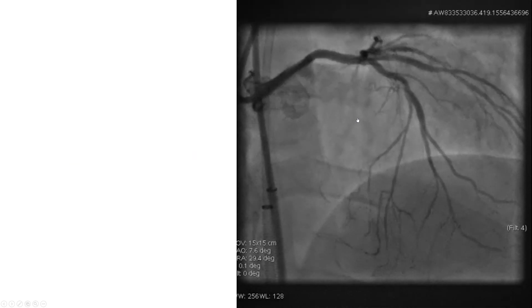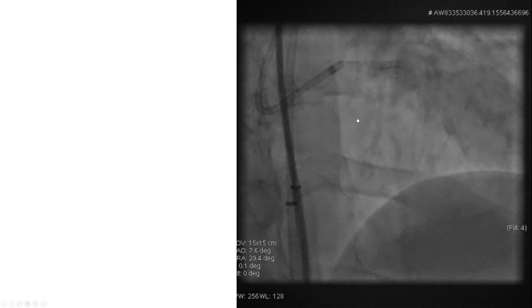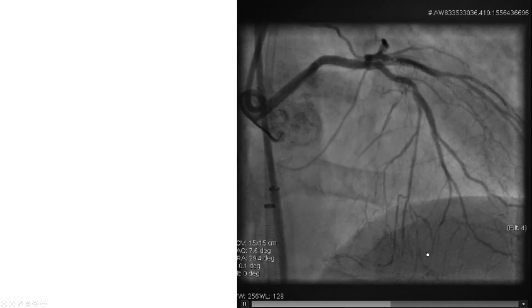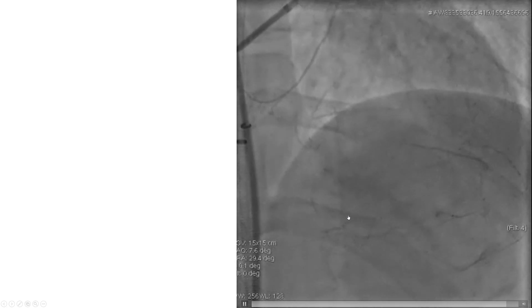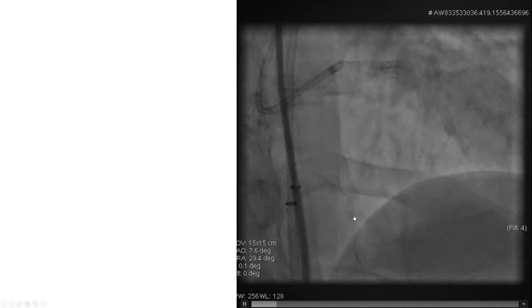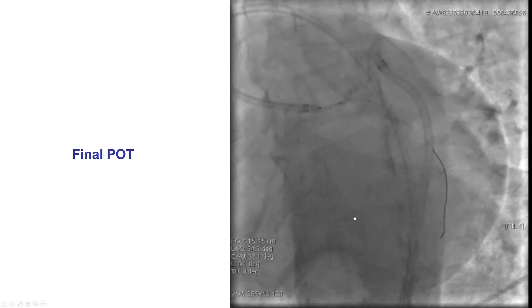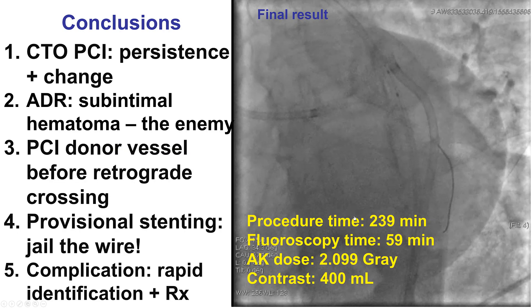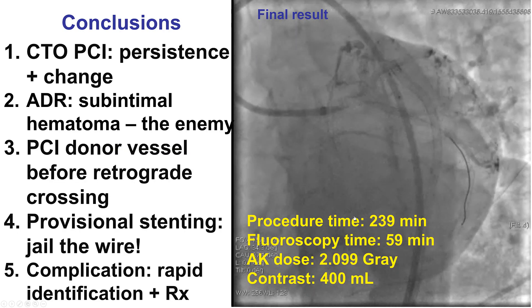That provided a nice final result with good flow in all three vessels — LAD, ramus, and circumflex. We still have some collaterals to the right, but sometimes it takes time for those collaterals to regress after restoring flow. Final proximal optimization technique, and this is the final result.